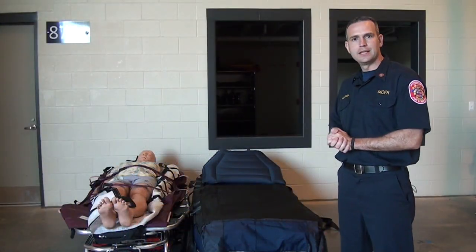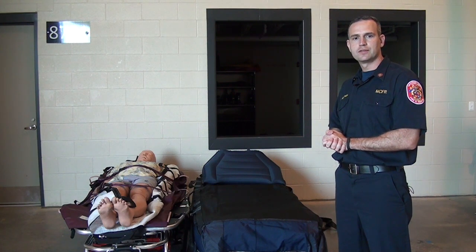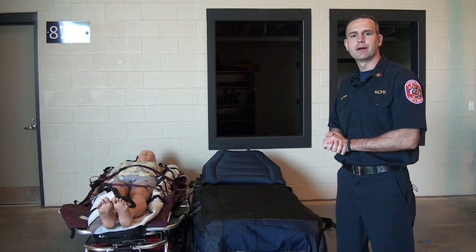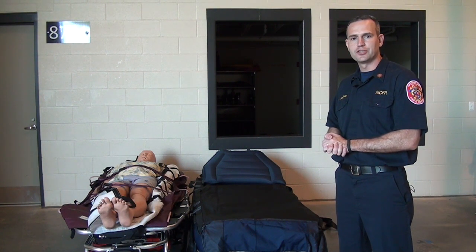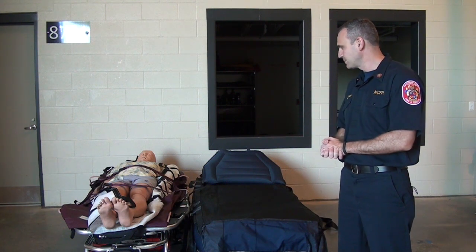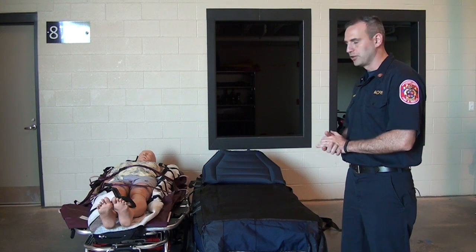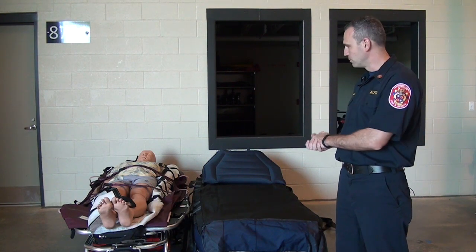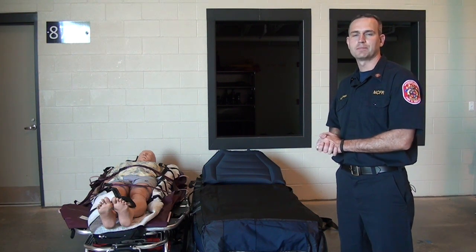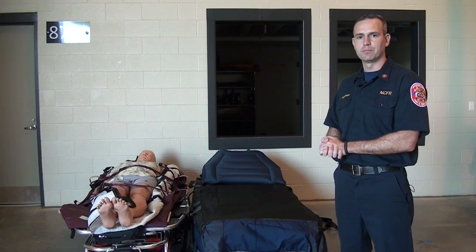We've seen how to use the hover jack and the hover mat to transfer patients. The crews that came from the stations carrying the bariatric equipment will come with you to the hospital. You'll be the patient care provider and they will assist you with the equipment and patient transfer. They'll come with you to the hospital so that the hover jack can be used to transfer the patient to the hospital bed, since the hospital bed will be too high a platform to move the patient from your stretcher directly.